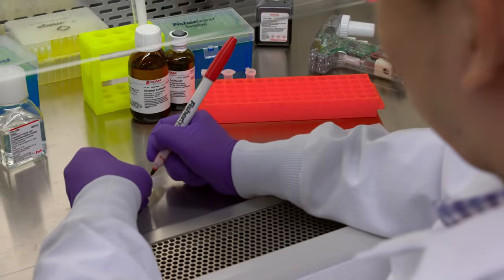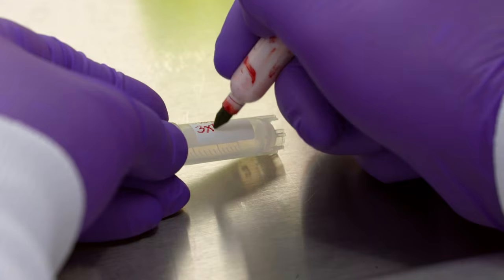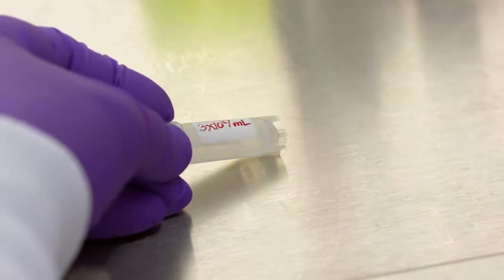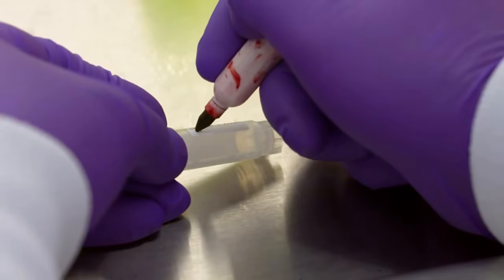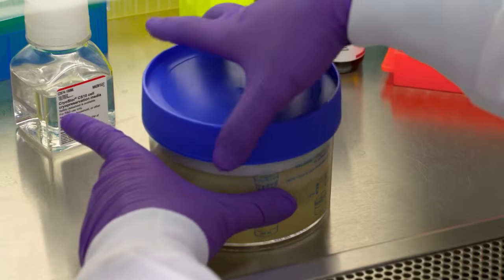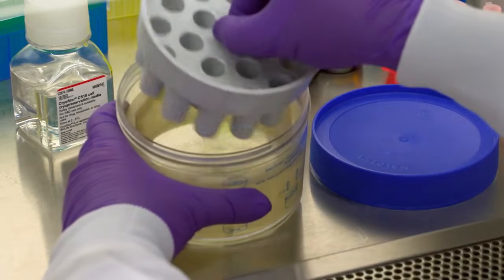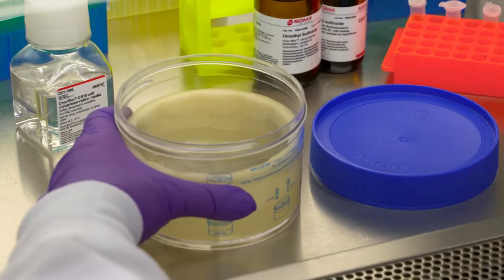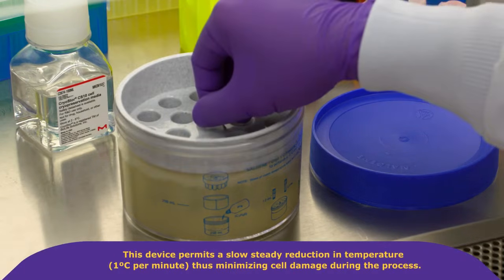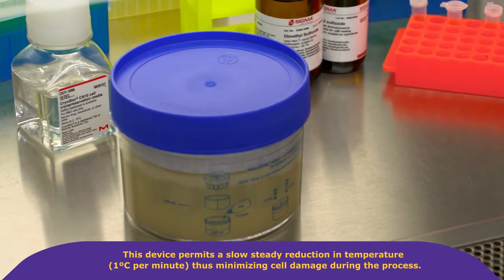To minimize cell exposure to DMSO at room temperature, it is a good idea to label the cryo storage tube before starting. Include the cell type, passage number, date of freeze, and cell concentration. Also prepare an appropriate freezing container with the right volume of isopropanol. This device is used to transition cells to freezing. It permits a slow, steady reduction in temperature, 1 degree Celsius per minute, thus minimizing cell damage during the process.